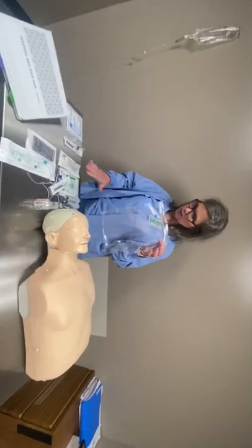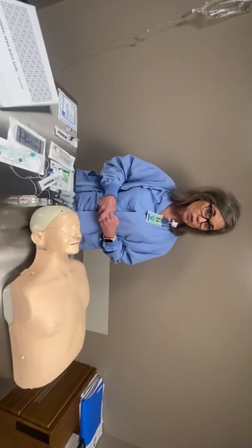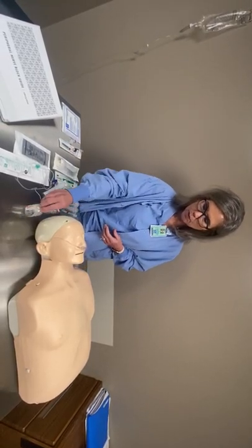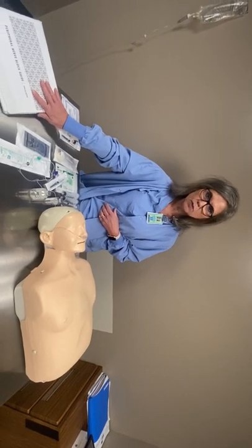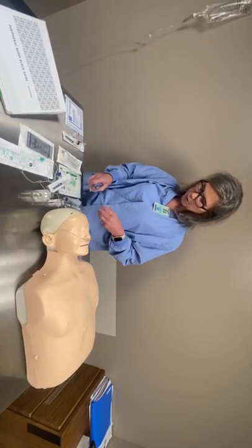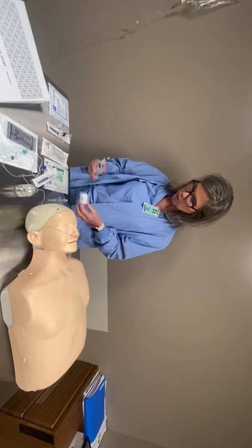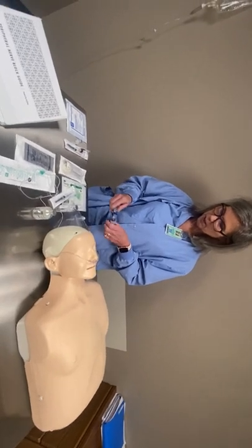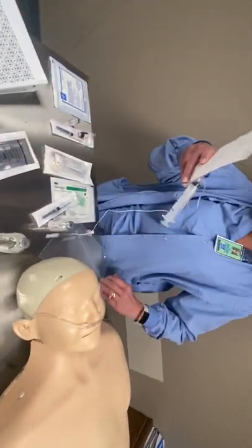Grab your kit — I've emptied it onto this tray right here — and collect everything you're going to need. For a single shot injection, which is what we are demonstrating now, you will need 0.5% ropivacaine and more than likely lidocaine for the local. I've grabbed my ropivacaine and I'm going to pull it up into two different syringes — it's 30 mils, so 15 mils in each one. Then I'll hook it up to my stopcock and to my needle, and have that all ready to go. I like to put everything back into my bag so it's easy to carry to the patient's bedside.